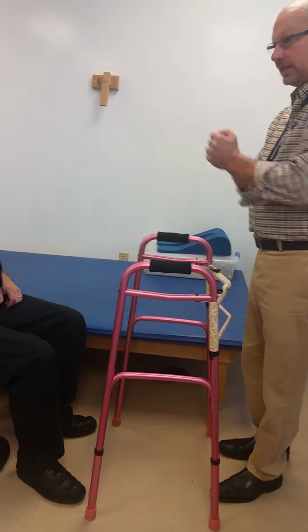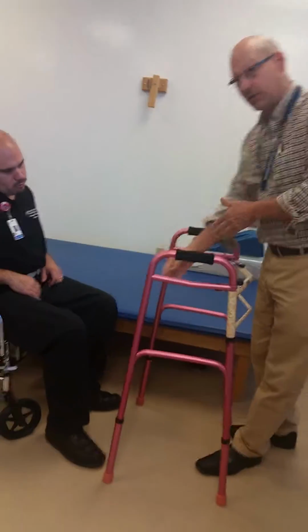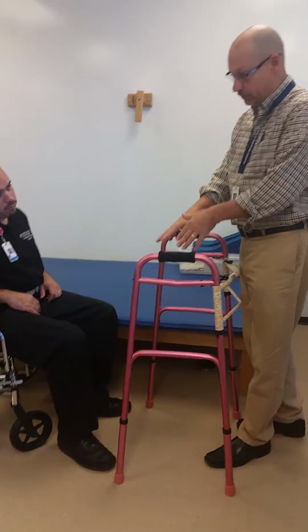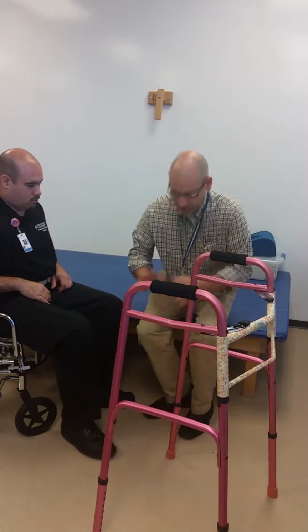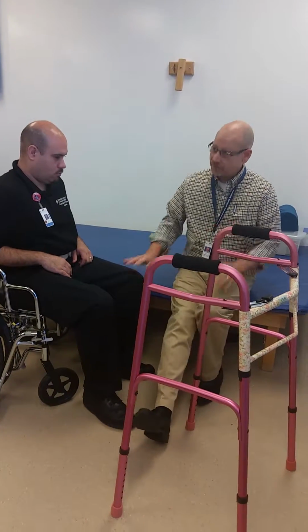So now we got to get to the standing position. So he's weight bearing as tolerated. Randy, you know, once we get standing up, you can put as much weight on that leg as you can. All right, it's up to you. All right, so now we have to do something. Randy's got to be able to stand up.